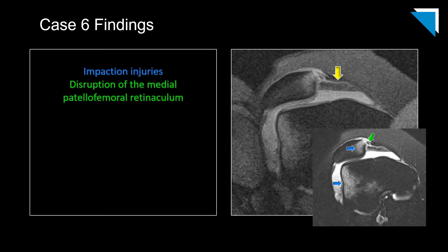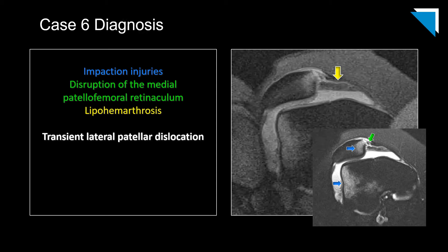There is also a large lipohemarthrosis; the fat component is somewhat easier to see on the proton density sequence. This constellation of findings is consistent with transient lateral patellar dislocation. One of the things I enjoy about musculoskeletal imaging is the search for injury patterns and mechanisms of injury. In this case, the injury results from a blow to the medial aspect of the knee, resulting in lateral patellar dislocation.